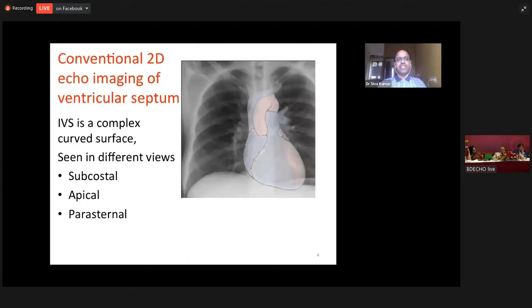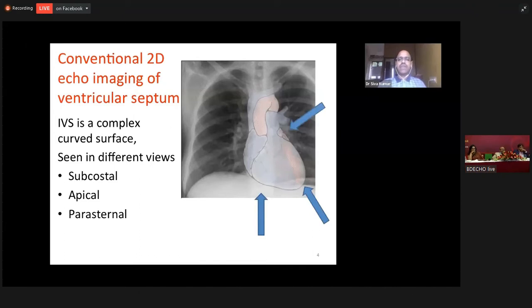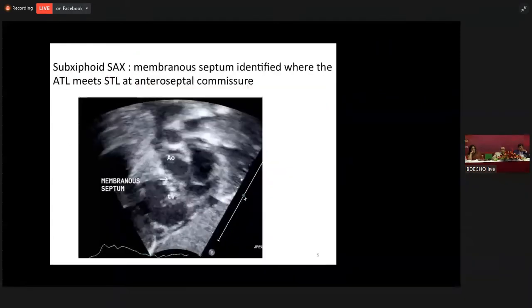Conventionally, echocardiographic imaging is done by three different views. We have subcostal view, we have apical view, and we have parasternal view. So we approach the heart in these three different views and we look at the intraventricular septum.